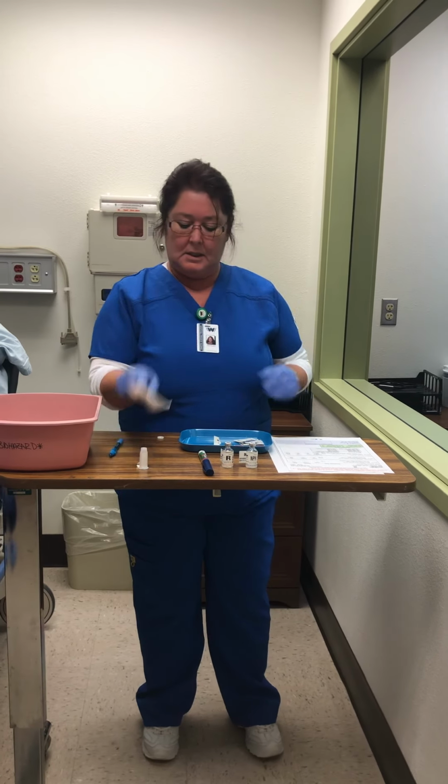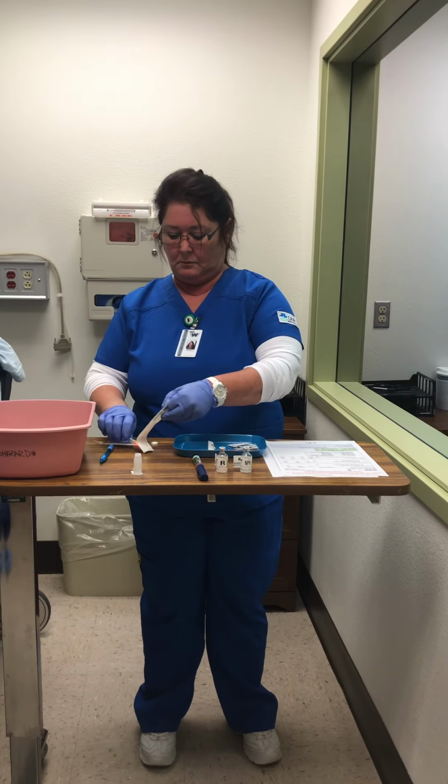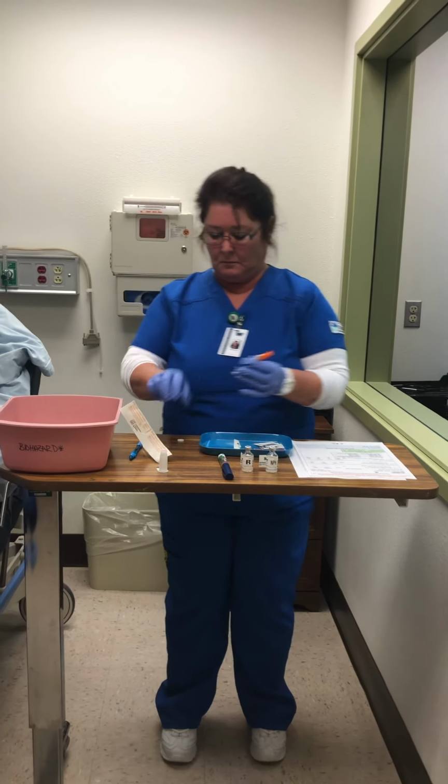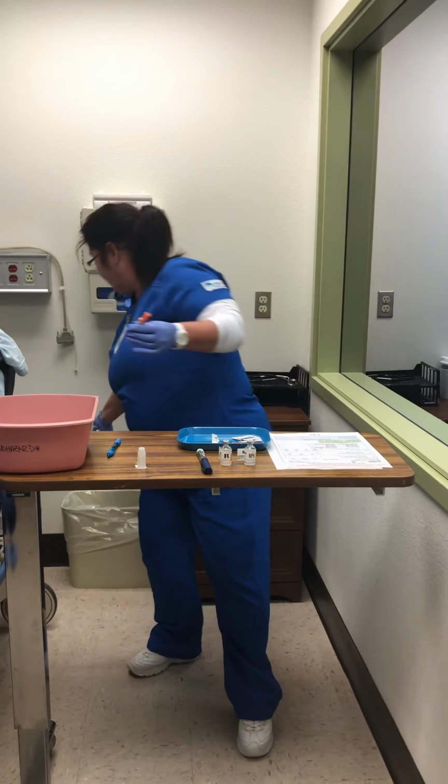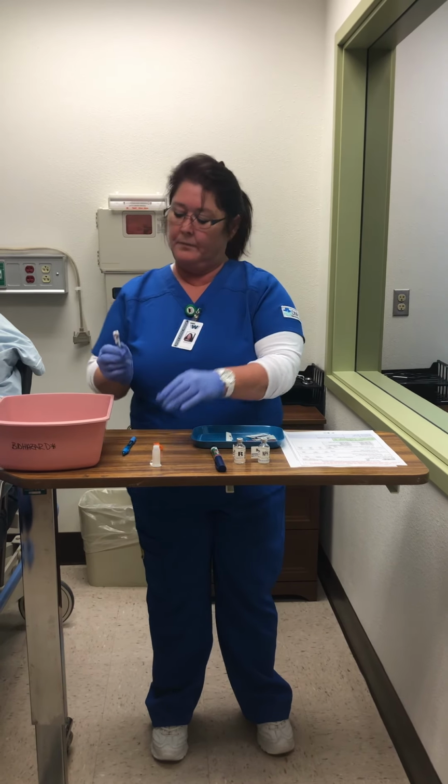And I'm now going to get my insulin needle, and I'm going to take off the top.